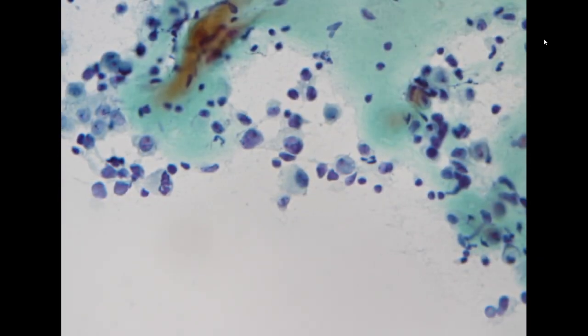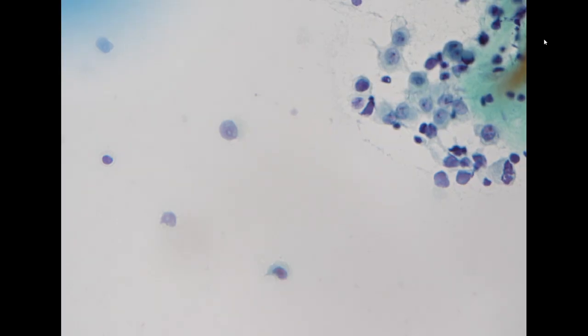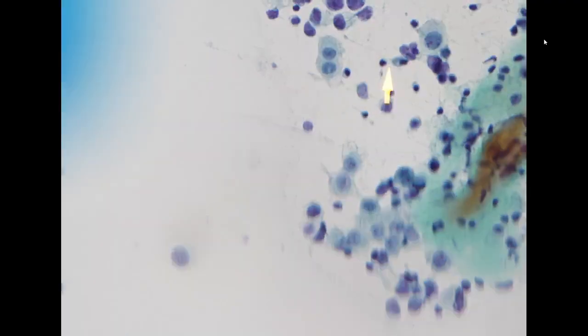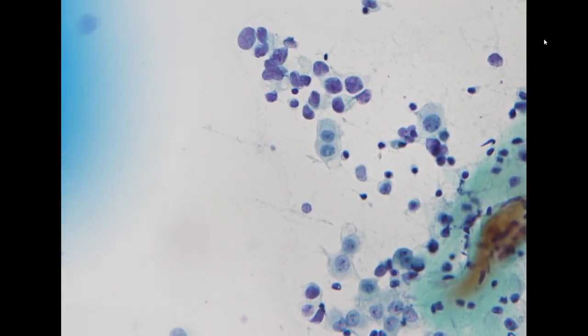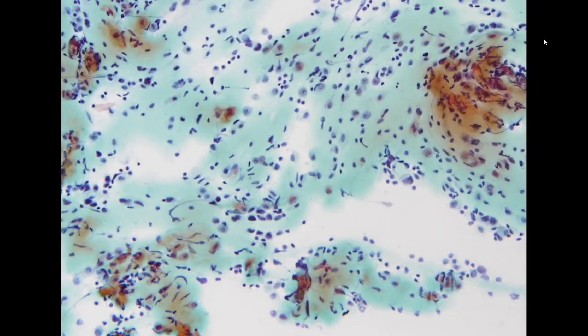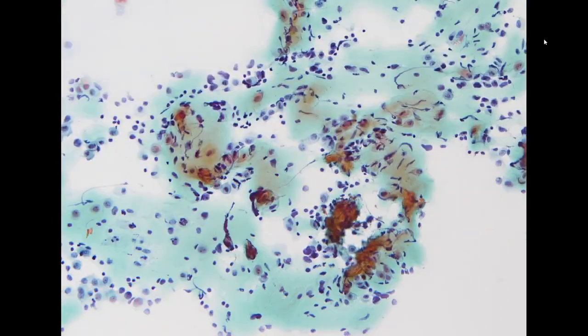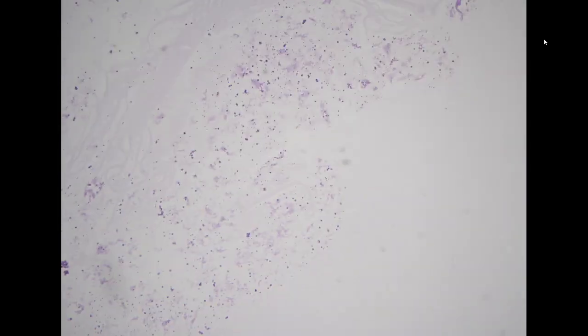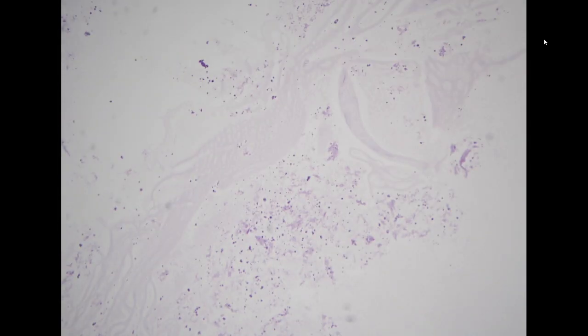But yeah, I think some of the cells are indeed histiocytes, so it's very difficult to make a distinction. However, some of the cells do have hyperchromasia, but without prominent nucleoli. So this is kind of difficult, and we sent out this case as negative. But because now we have a positive specimen, I would order the MOC31 for the prior specimen.